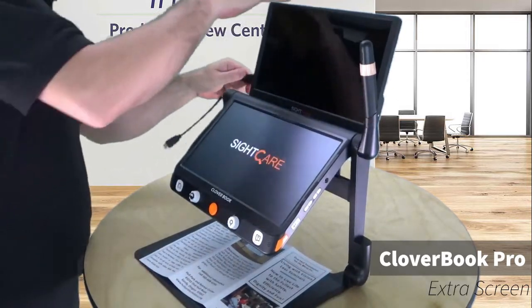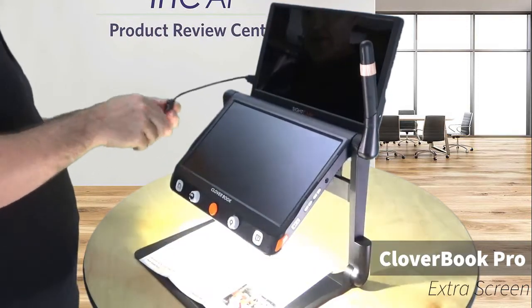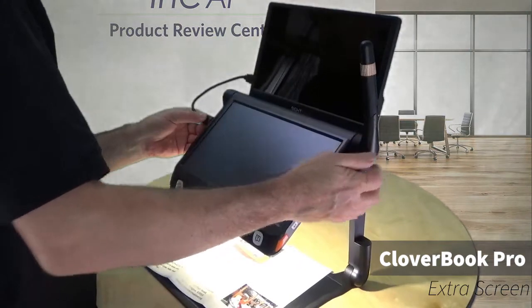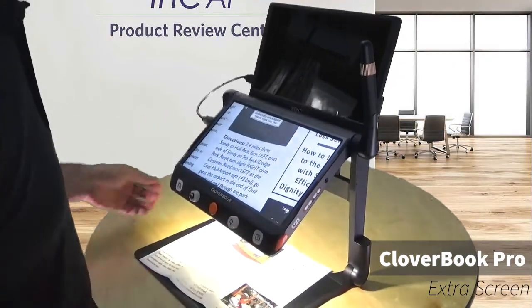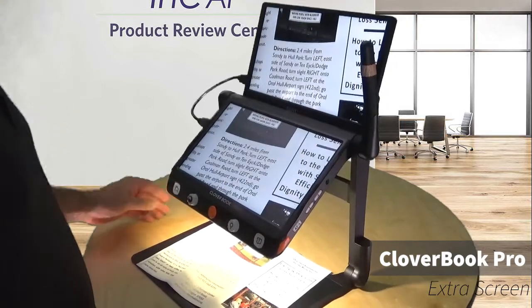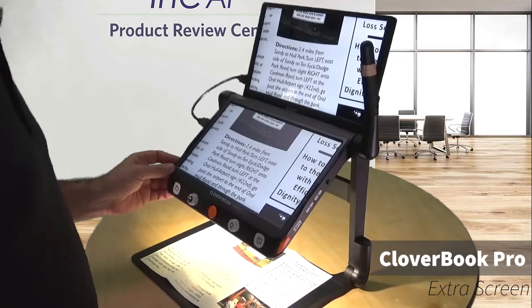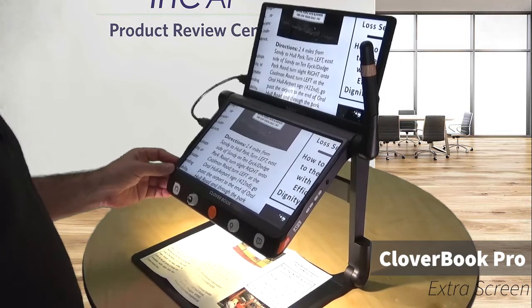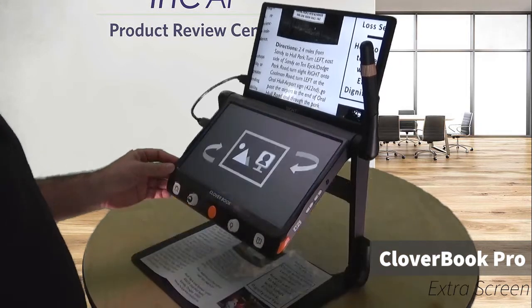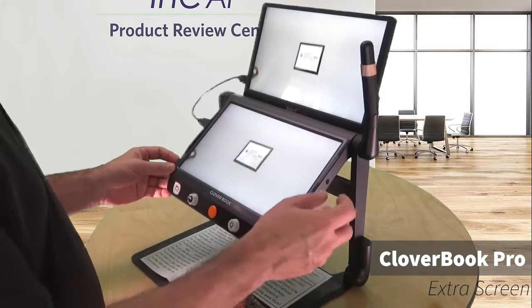You just have to connect the HDMI cord that comes with it into that screen, and then into the magnifier. Go. And that's initially going to duplicate my screen. But then I can use the button that I use for my split screen to do all kinds of fun things now. I'll hit this, and now I have a distance view shown on both screens.